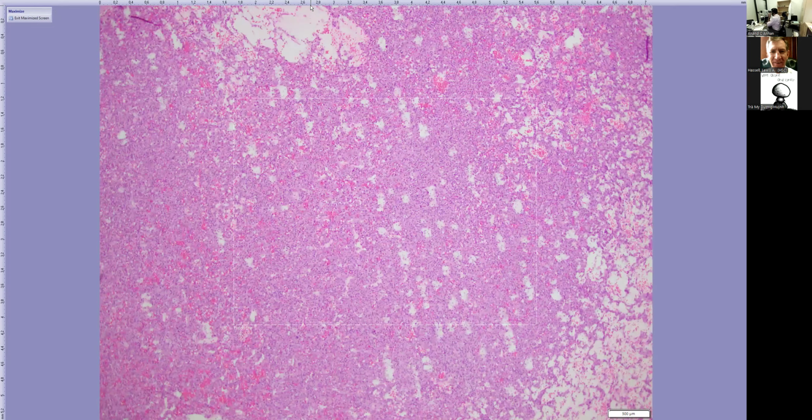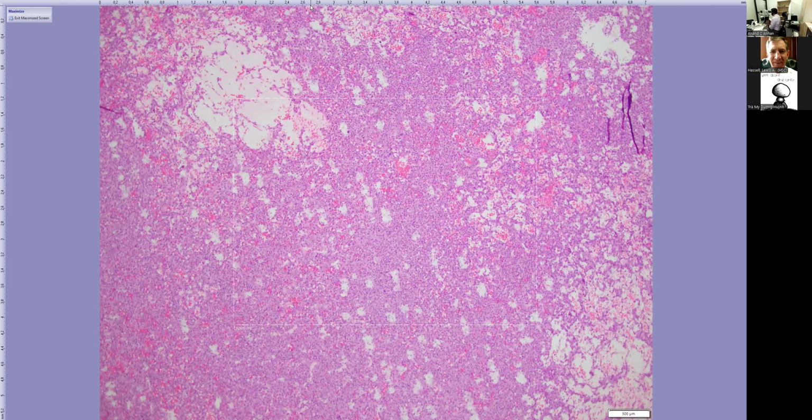And to be honest, I came to that as a last differential based on ImmunoQuery, which is a software that we have a subscription to, where we can plug in some of the markers that we get positivity for based on IHC, and it will show possible differentials. So as I was going through all the differentials, it did say a case report of juxtaglomerular cell tumor, which can have CD34 expression and negative for PAX8 and maybe positive for some muscle markers.